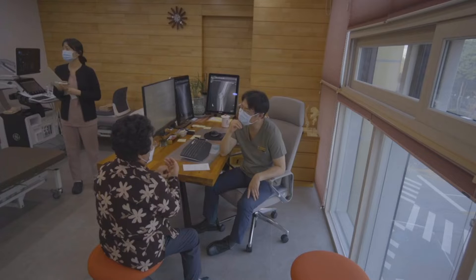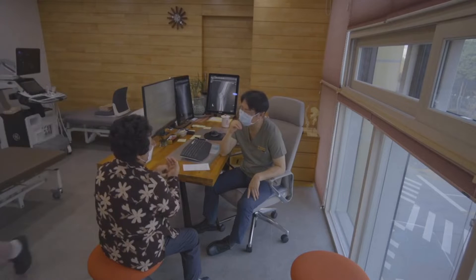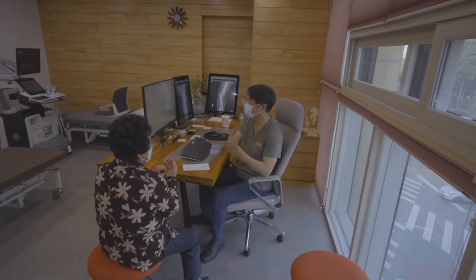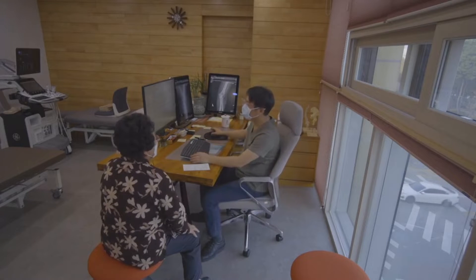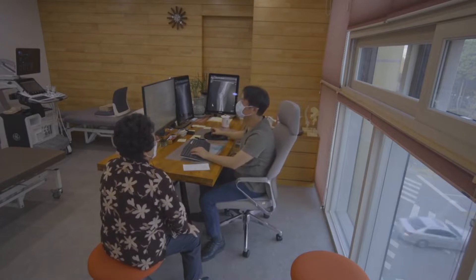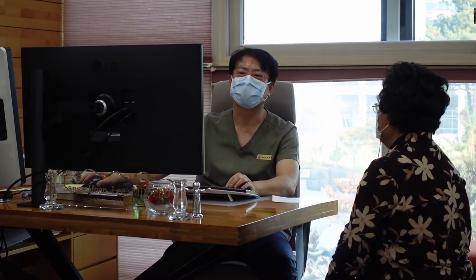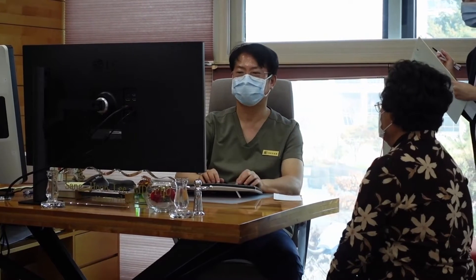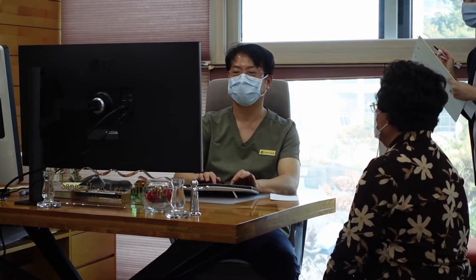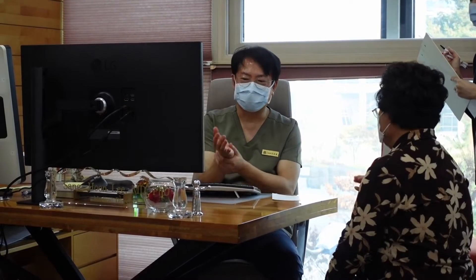I will share the procedure for relieving postoperative pain after the carpal tunnel release operation. She received surgical carpal tunnel release two years ago. The tinglings of the entire palm and fingers are the main symptom. She felt the pain was extending proximally into the shoulder when the pain was intense. The pain became worse after COVID-19 infection one month ago.